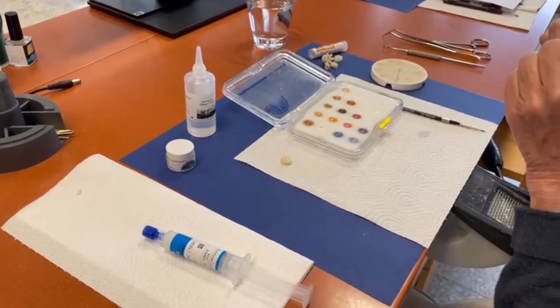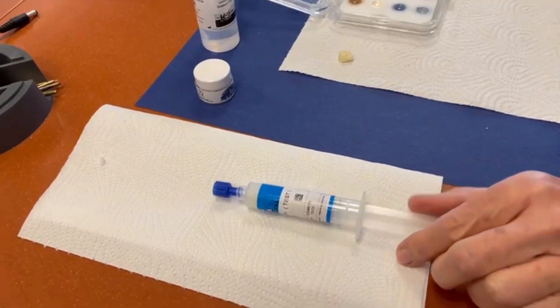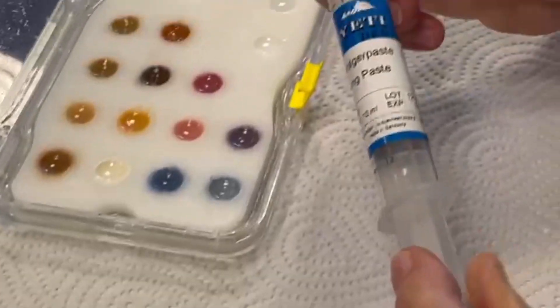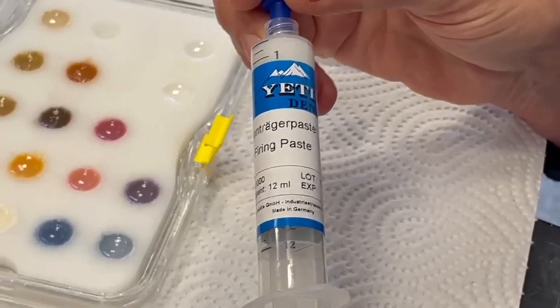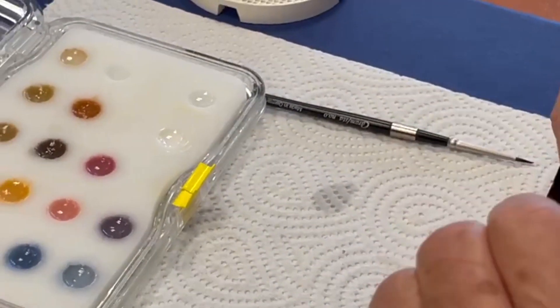Good morning, once again back in our laboratory. Today we want to show you a very nice and helpful product called fix firing paste. This fix firing paste is for all ceramic crowns or metal ceramic crowns.